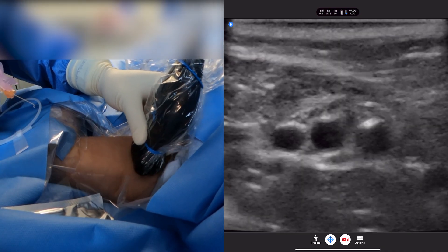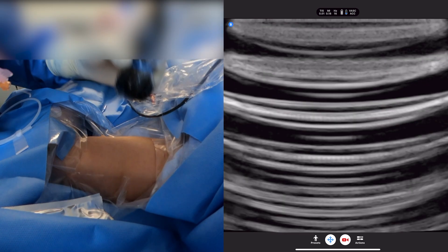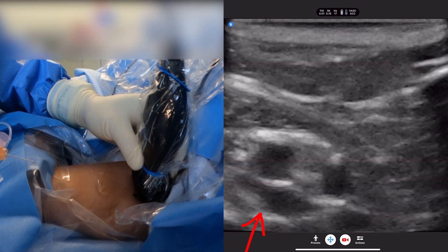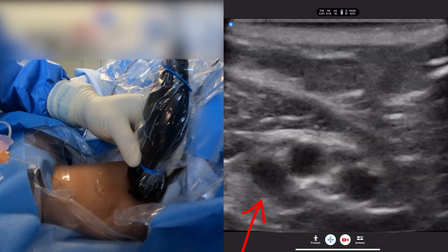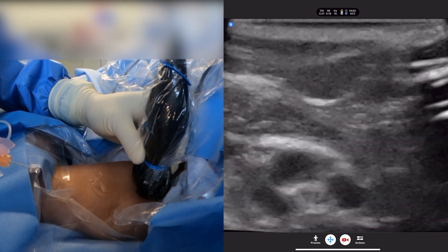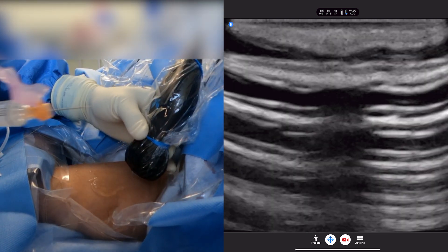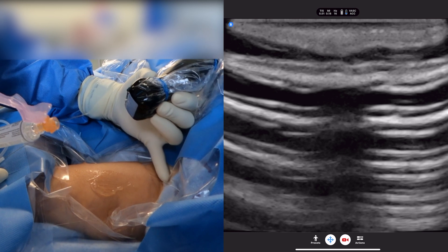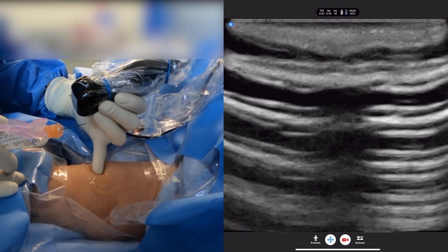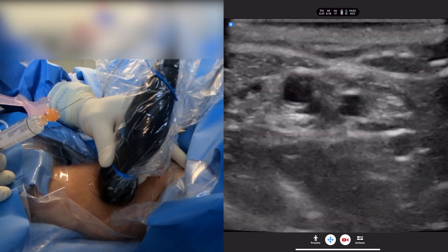All right, looks like we're going to go for that basilic or that brachial on the left or on the right side. It's a good straightaway too — it doesn't shift like that. That one on the left shifts to the right. So I think it'll be better to do it more straightaway, straighter vein, which is going to be about from the axilla crease to the AC crease. We've got our midpoint right about here, so we're going to inject at this point.